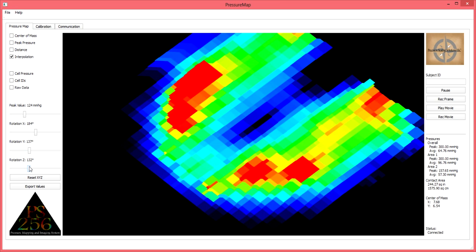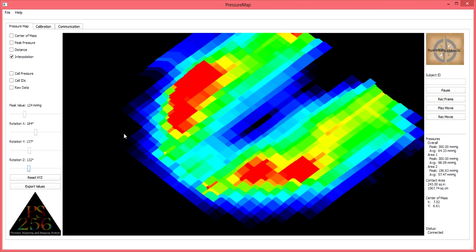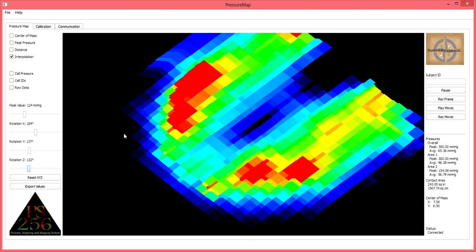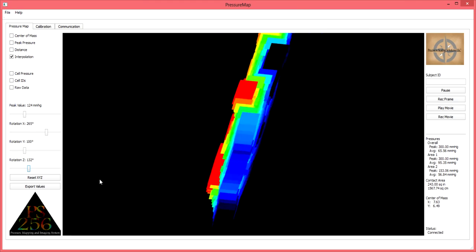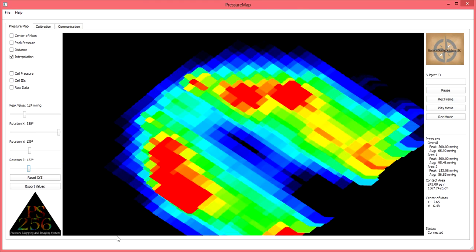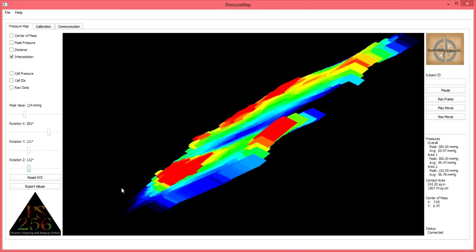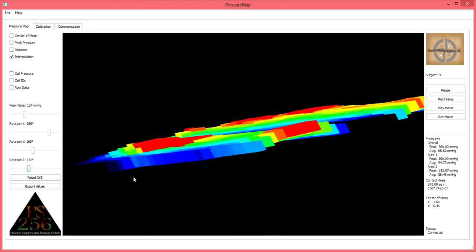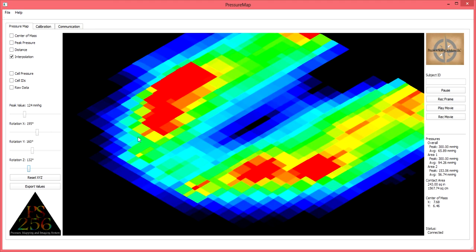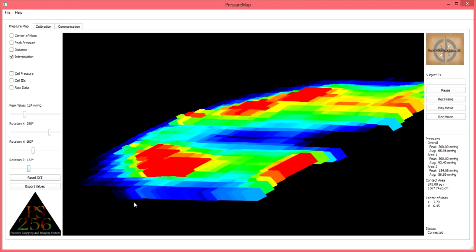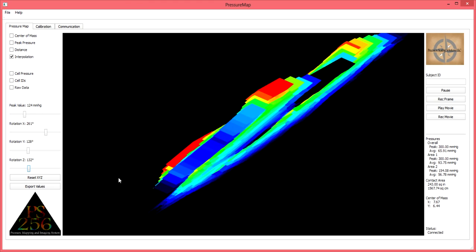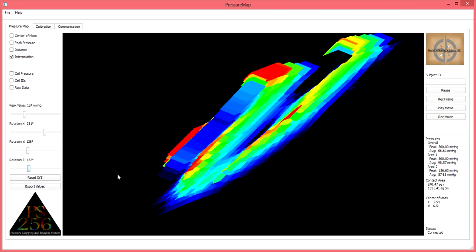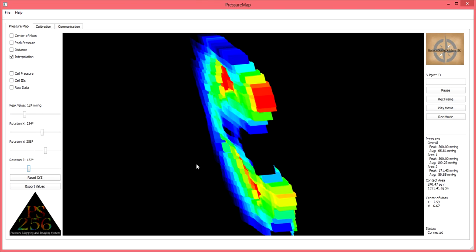An additional rotation option is available by simply placing your cursor on the image itself. Left click with your mouse and drag the mouse in the direction you would like to rotate the image. As you drag the image to rotate it, you will notice three rotational slider bars to the left, continually adjusting their X, Y, and Z axis readings accordingly.